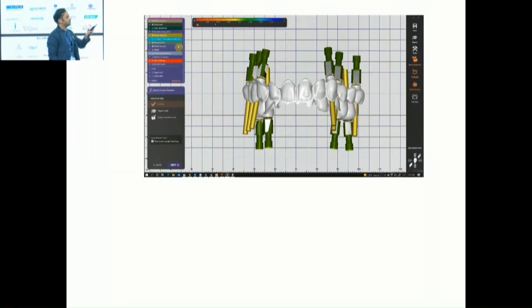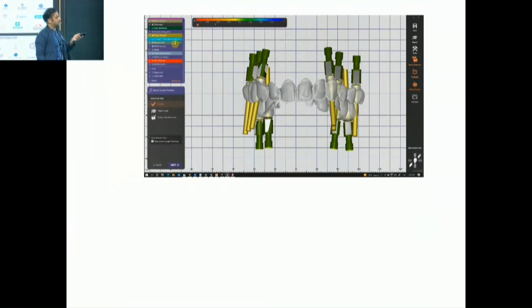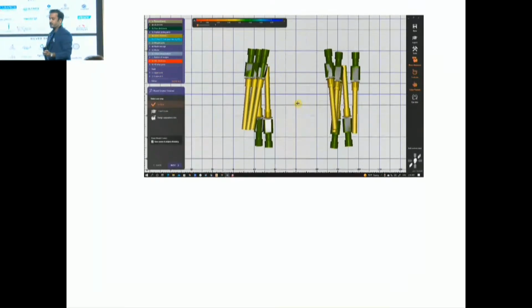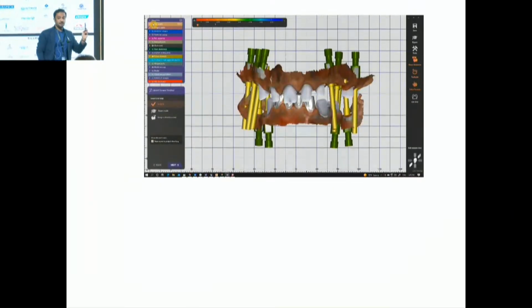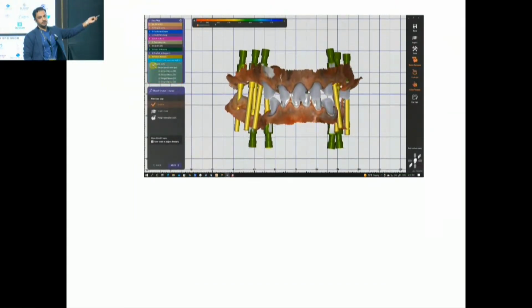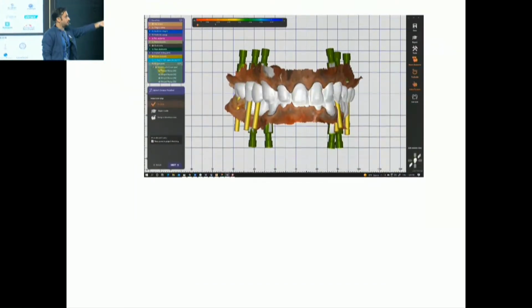Cases in 2020 where I've done full mouth rehabilitation for a patient of mine. Implants, crowns, veneers, all of them in one case. And I don't really need to go to the lab. No need. Just send me the image, send me the STL files, let me check it.